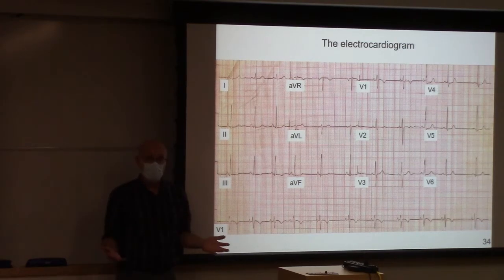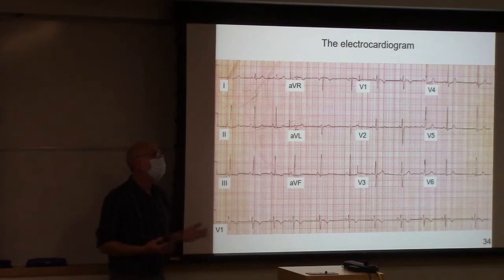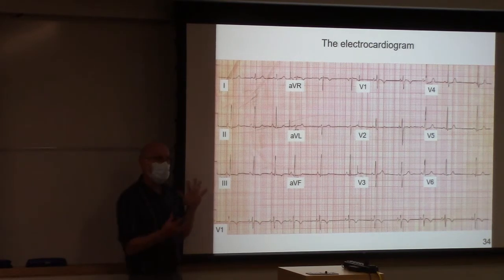In the ambulance, when they hook up an electrocardiogram, they don't do 12, they just do 1. In the lab, we're going to do 3, because we don't have the ability to do all 12. But in the hospital, when they want to get the most information, they connect all 12.